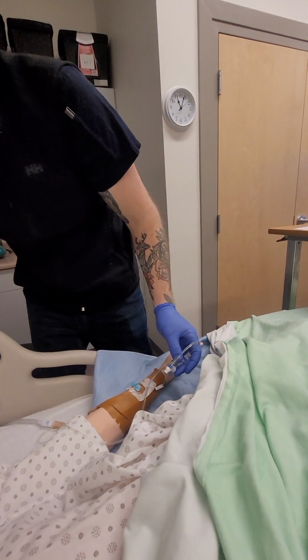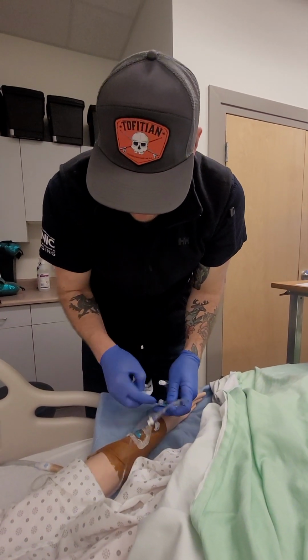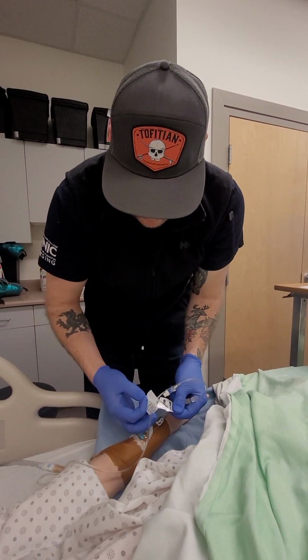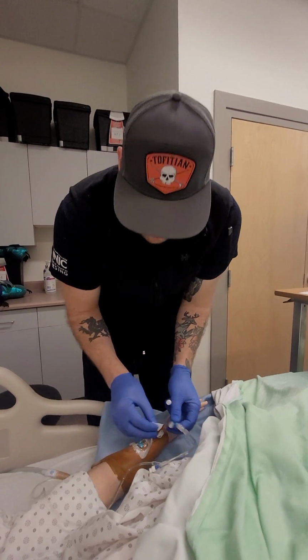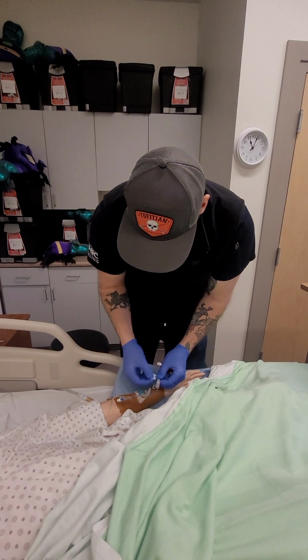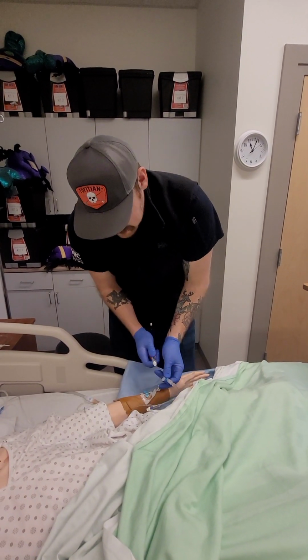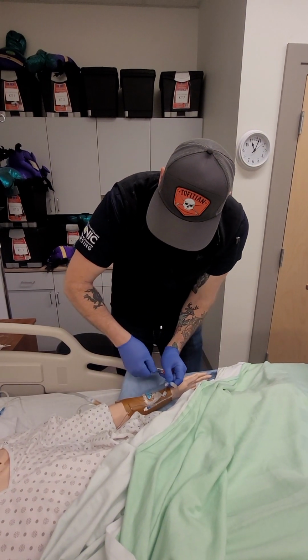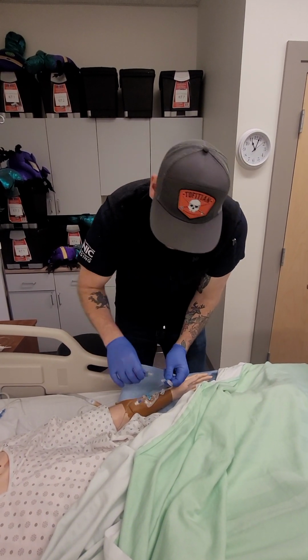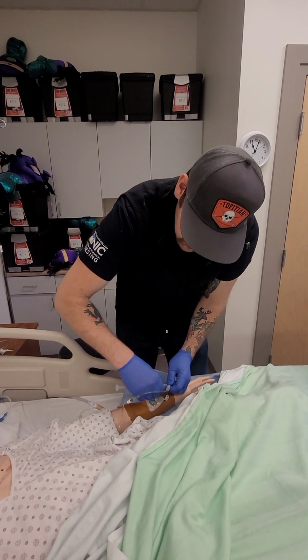So what I'm going to do, I'm going to have my saline here, and I'm going to be using this port here to check for patency. So we can take that off, 15 to 30 seconds cleaning that. And we'll also let that dry for 15 to 30 seconds. We'll take this off, get rid of that air, and we'll go ahead and put it in here.